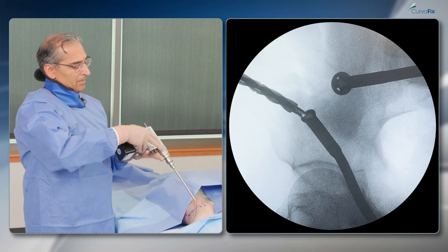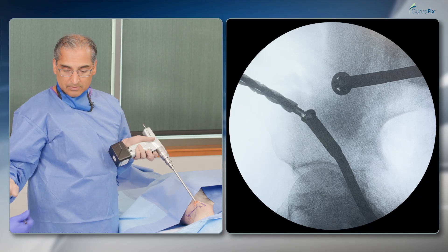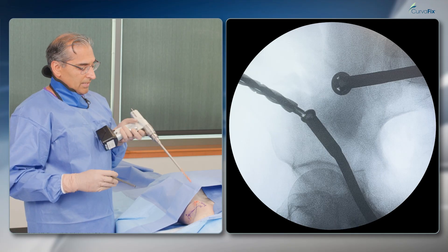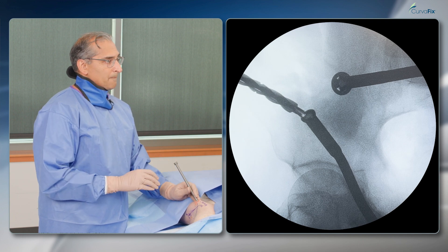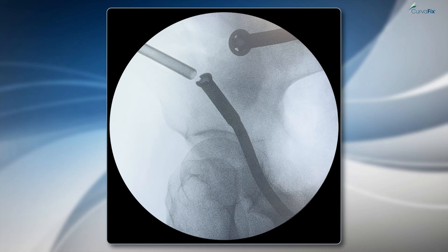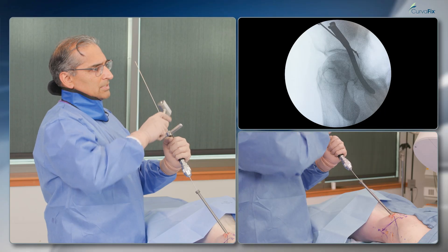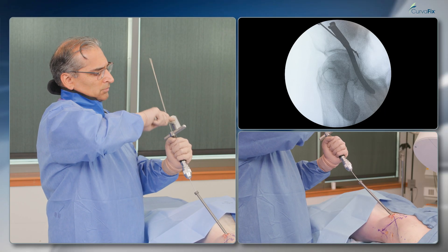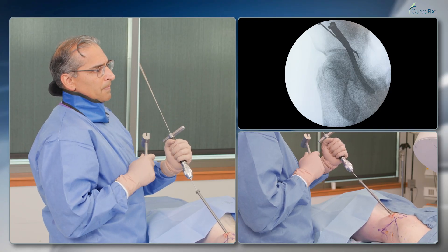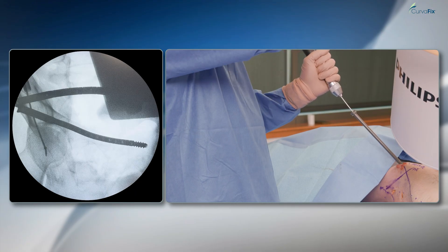You can see I'm in my iliac wing, heading towards the posterior column, with my drill far enough in. I'll take the guide and place it into my entry point. Now that my guide is in, I'm going to insert the ball tip guide wire, aiming towards the acetabulum. You can see it's curving around the acetabulum. On this view I've bisected the femoral head, and I'll tap this in a little bit more.